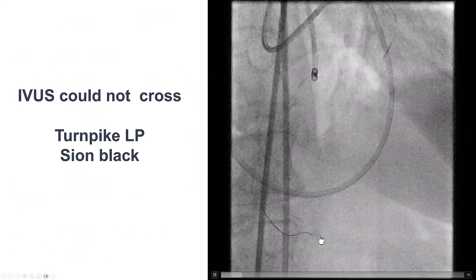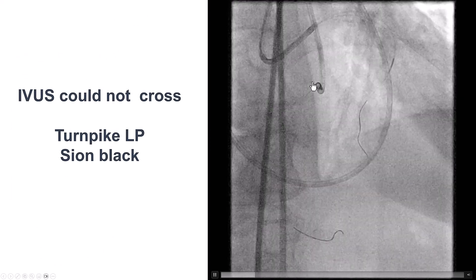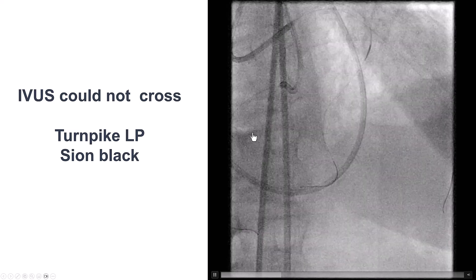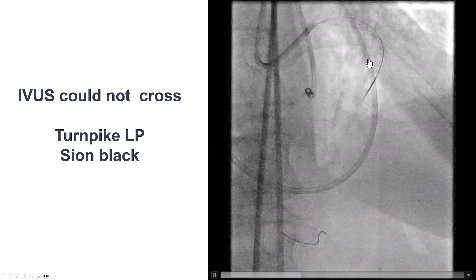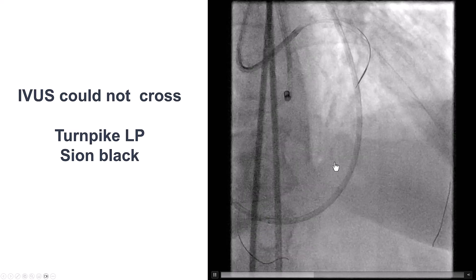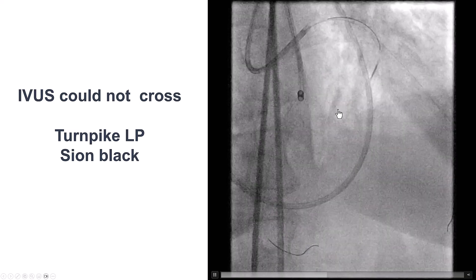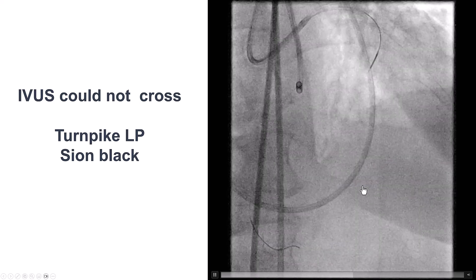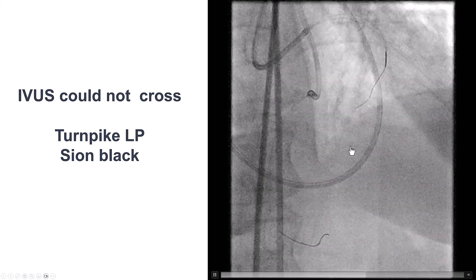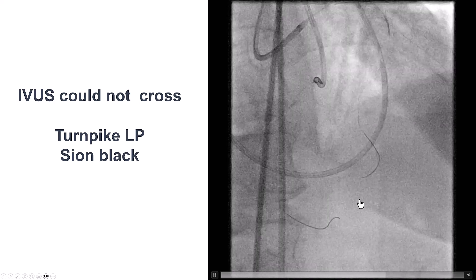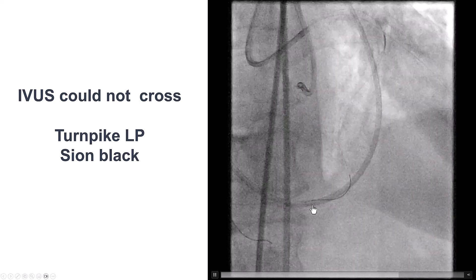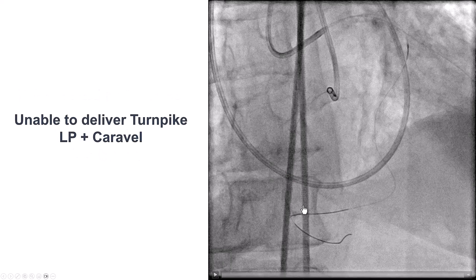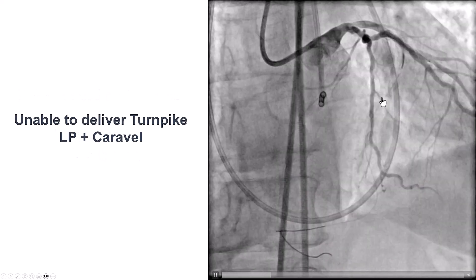We advanced the guide wire into the marginal, but we could not deliver an IVUS into the side branch. As a result, we decided to switch to retrograde crossing. This is a Turnpike LP with a Sion black guide wire, and during surfing, we were able to direct this wire all the way into the PDA. It took a while — it's a tortuous course, but the wire seems to go in the right place, so we did an injection to confirm.